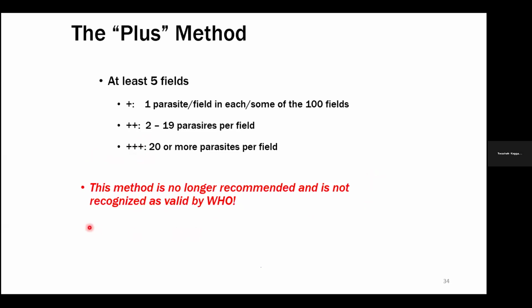But WHO currently doesn't recommend the plus system, but we use it since it is what is understood by most of our clinicians, but it's not a WHO recommended method. So we need to discuss this with our clinicians. If we are doing clinical work, then take them through the parasite-based method.